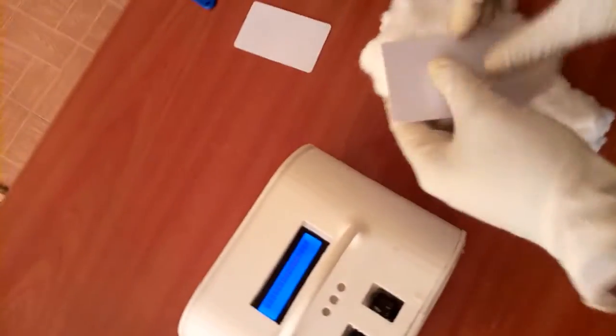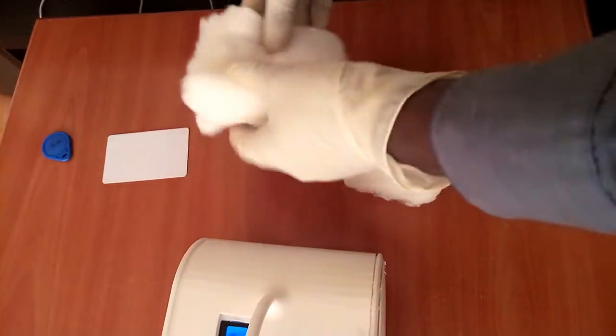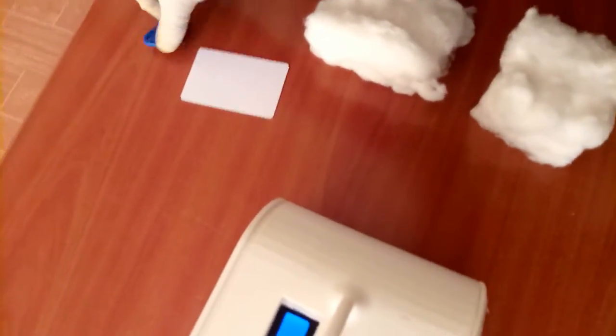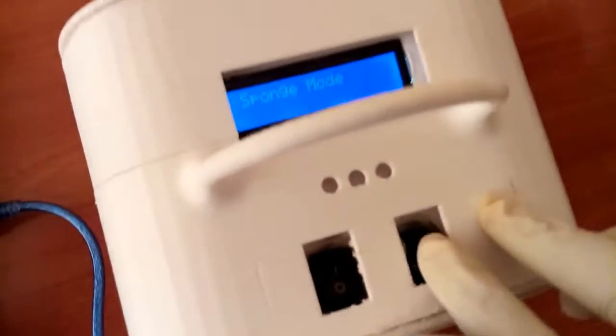Okay, similarly, we are also supposed to track the number of sponges used in a surgical operation. In doing that, we are supposed to use RFID labels. In our case, we are going to use RFID cards and tags. I'm going to embed them inside sponges. Also embed this one. I'm in the sponge detection mode.